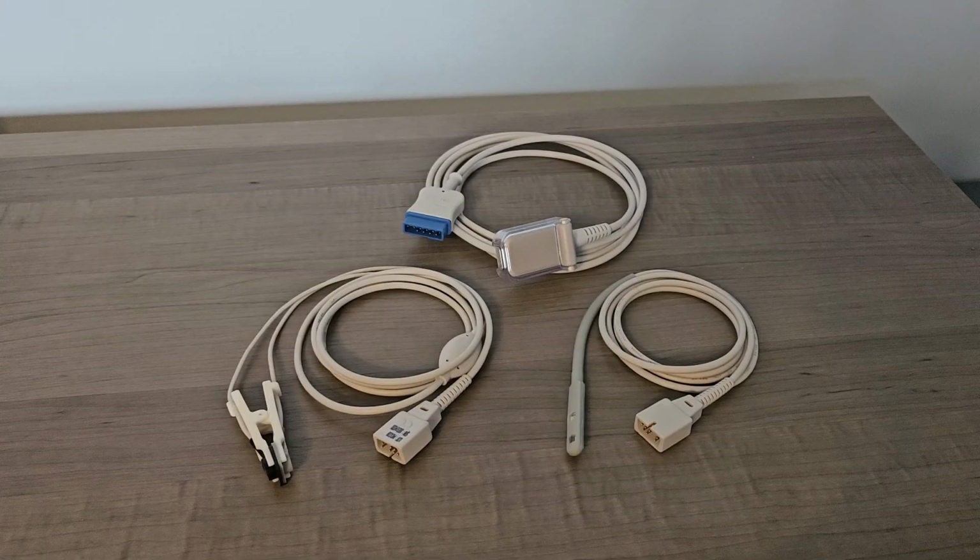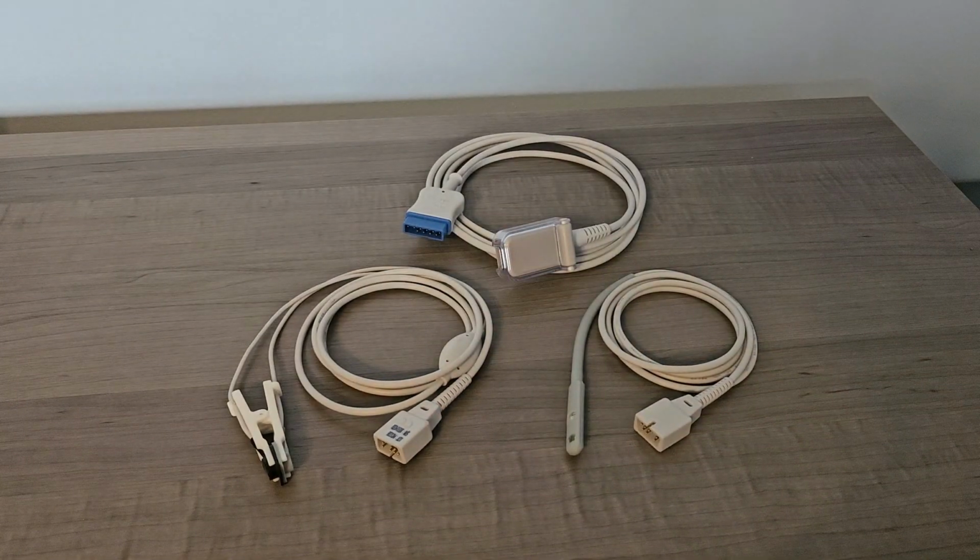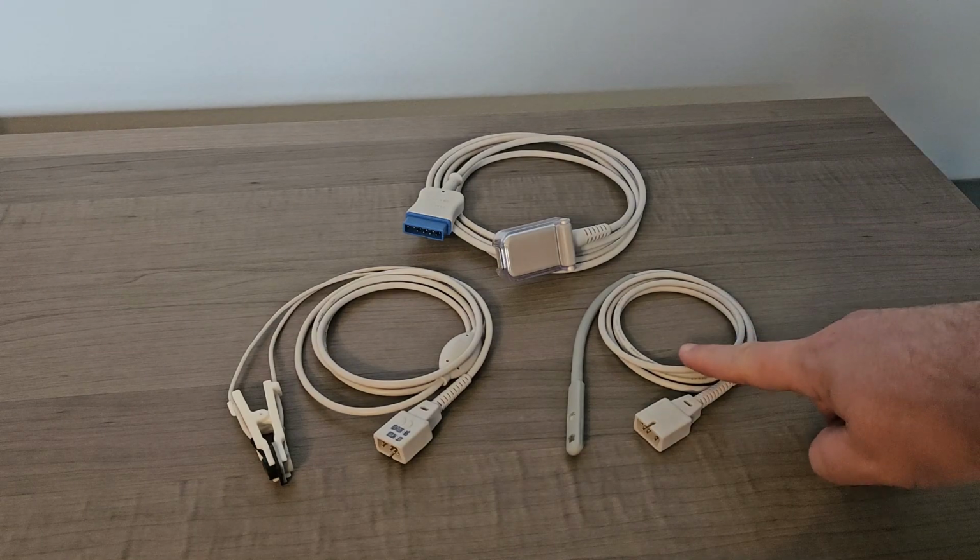Your patient monitor comes with 2 styles of SpO2 probe. The first is a classic Y-clip style sensor. It can be used on the lip, tongue, vulva, prepuce, webbing between the toes, or webbing behind the tendon on the hind leg. The other is a transflectance probe.